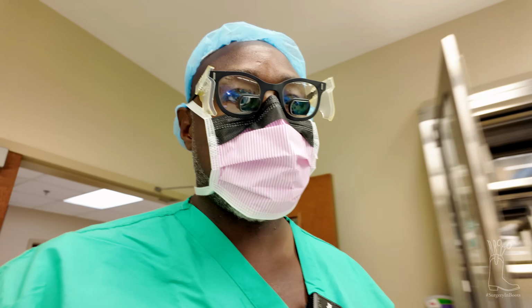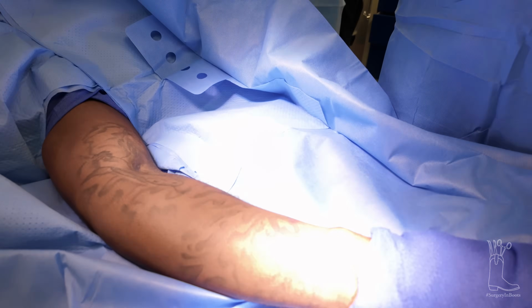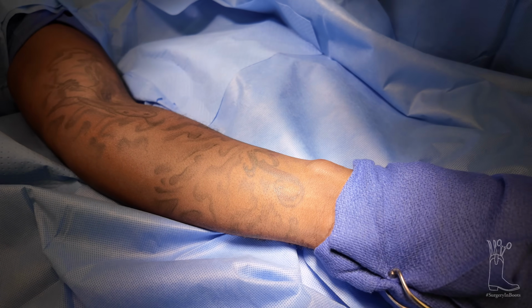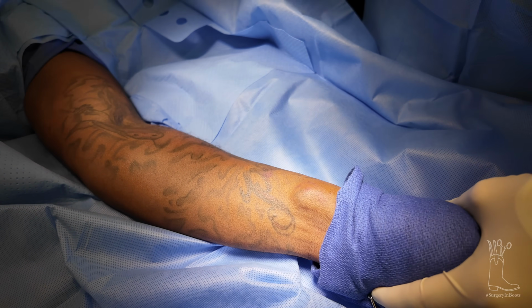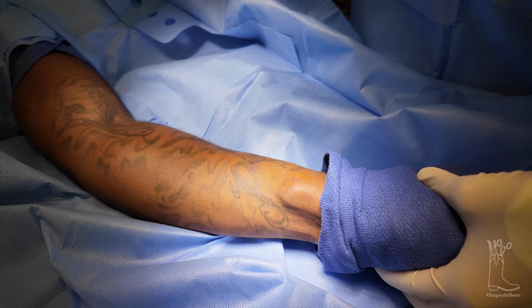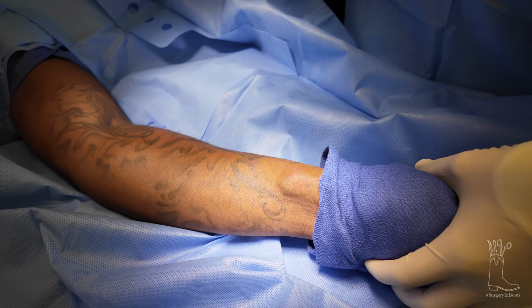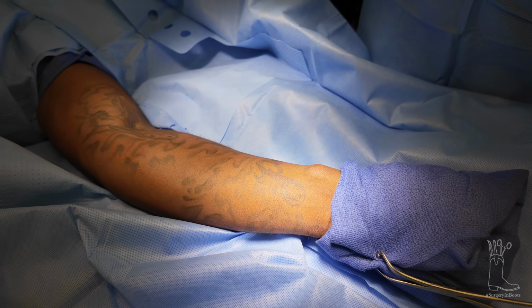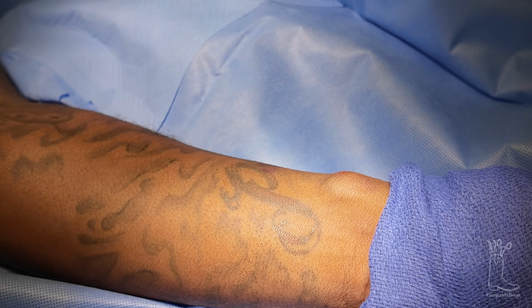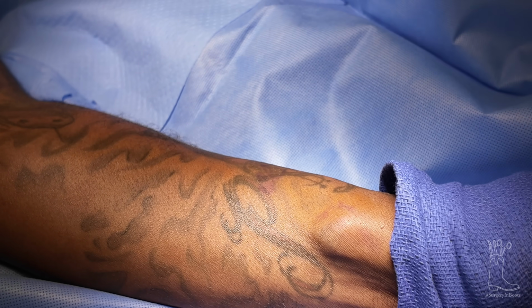Trying to make us all jealous. So that's it. Turn that hand for me a little bit. There you go. Other way. Perfect. You can see it bulges a little bigger when you turn it. All right, relax it. So it's smaller. So yeah, that is where we're going. I have to turn it again. Okay. Cool.